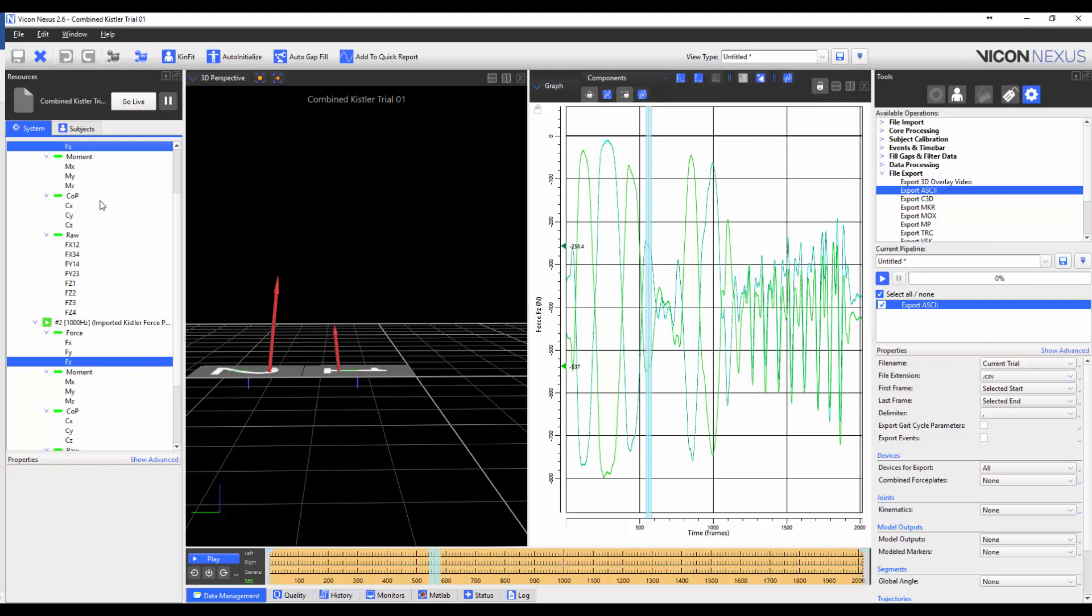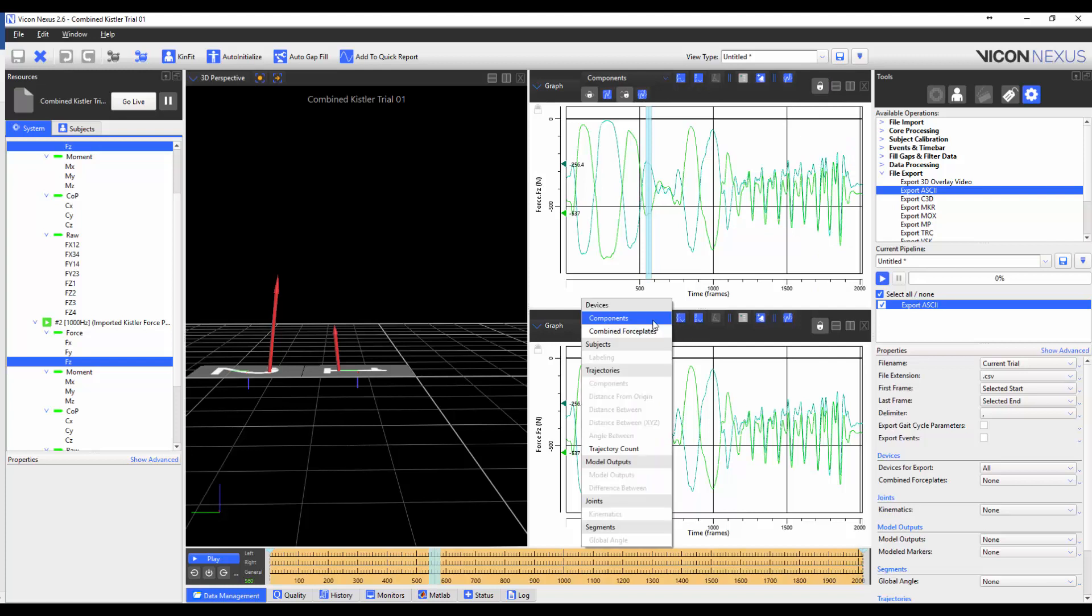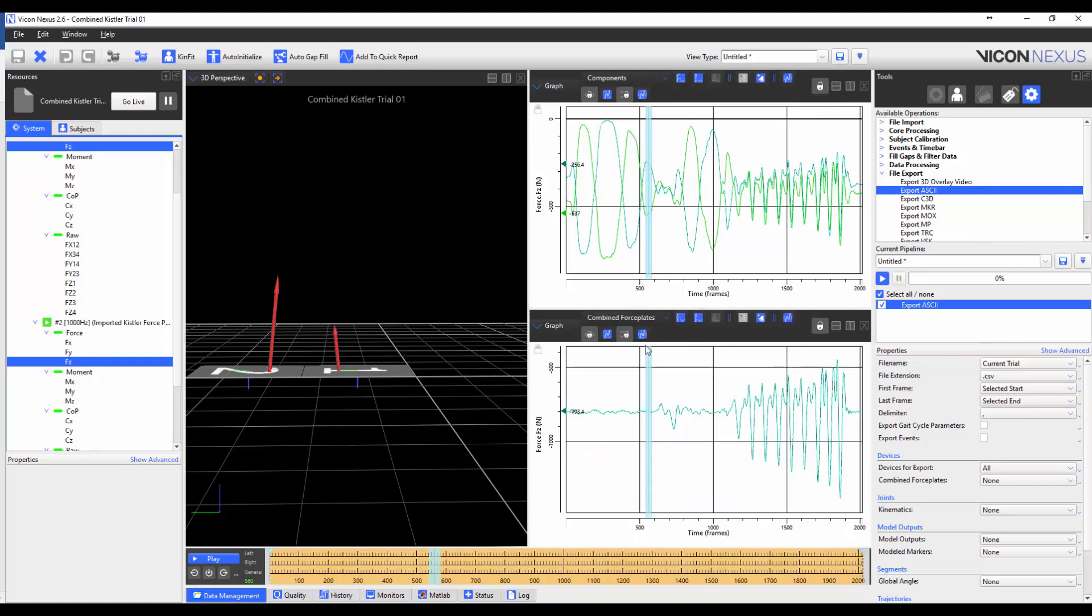I'm going to split the screen to create a new graph. And I'm going to select Combined Force Plates. You can see that the bottom graph is the two force plates summed together.